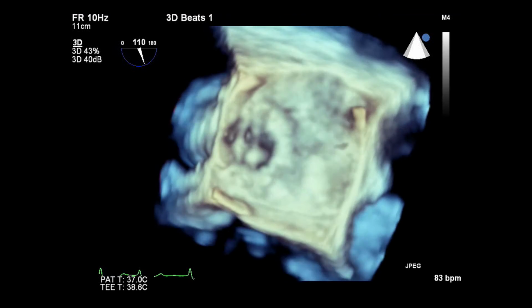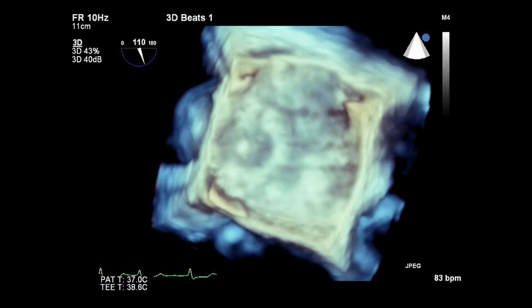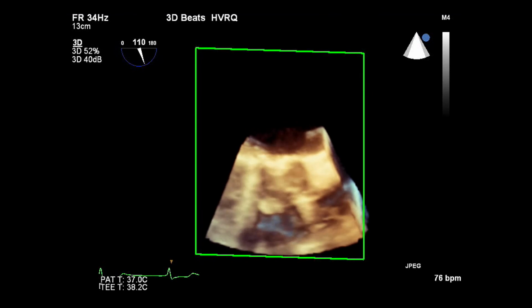I've done a 3D showing the occluders of the mitral valve to be working well. The mitral valve is interestingly slightly displaced within the dilated left atrium over towards the aortic root in this patient, which is further going to raise some issues during implantation.